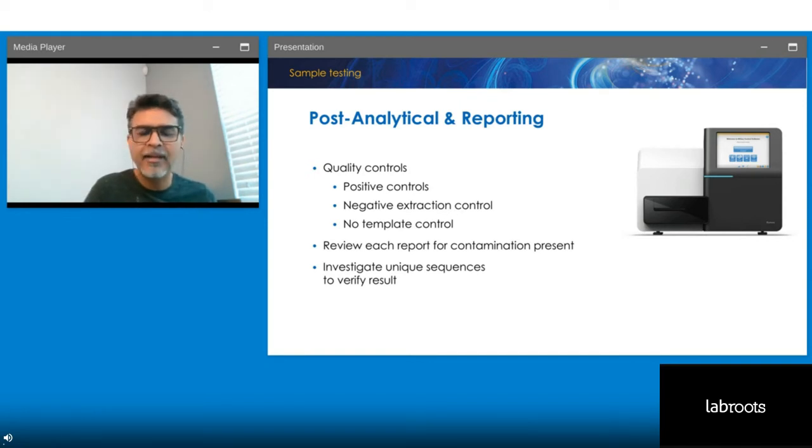So there is an automated quality control process that happens in the bioinformatic pipeline, but there is also a manual review done by an operator, in this case a molecular technologist, who reviews each of the results coming from the sequencer before they are released in a report.